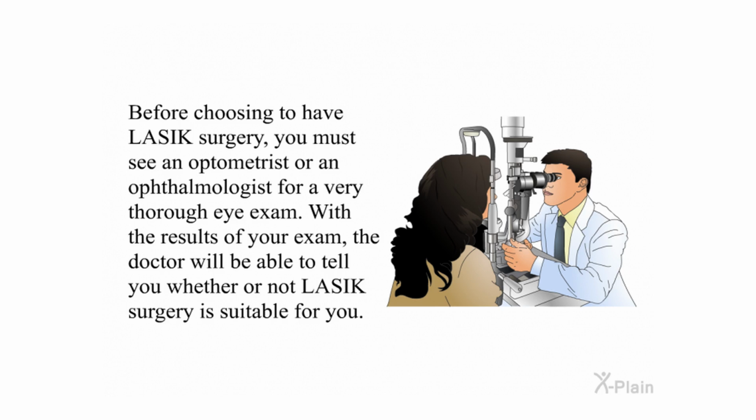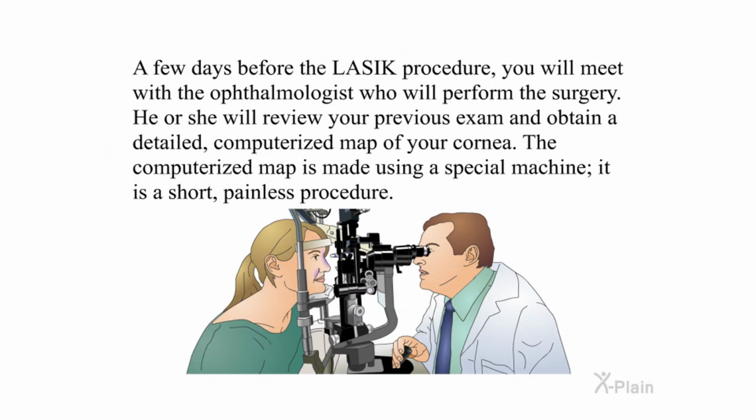Preparing for LASIK. Before choosing to have LASIK surgery, you must see an optometrist or an ophthalmologist for a very thorough eye exam. With the results of your exam, the doctor will be able to tell you whether or not LASIK surgery is suitable for you. A few days before the LASIK procedure, you will meet with the ophthalmologist who will perform the surgery.